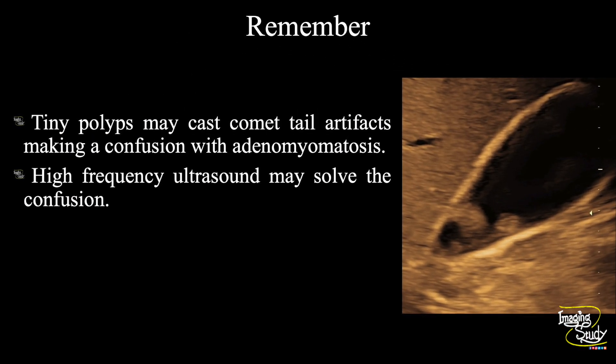Now the take-home message. Tiny gallbladder polyps may cast comet-tail artifacts, causing confusion with adenomyomatosis or cholesterolosis. You can change the transducer from the curvilinear low-frequency one to the high-frequency linear one to resolve this confusion.